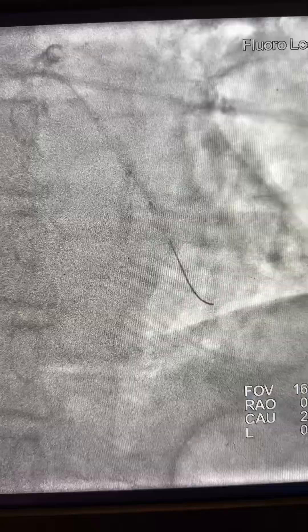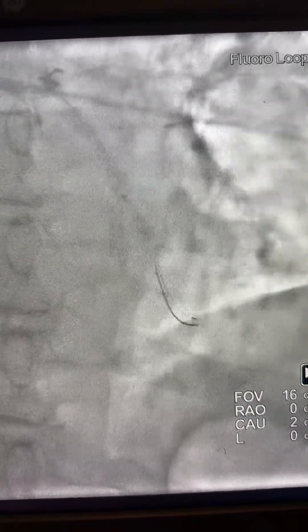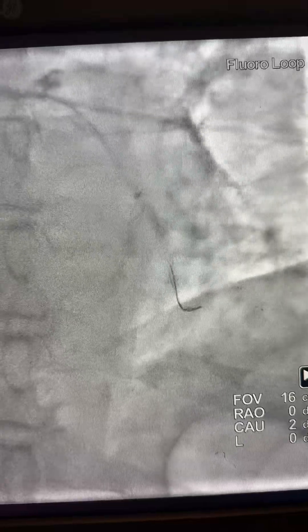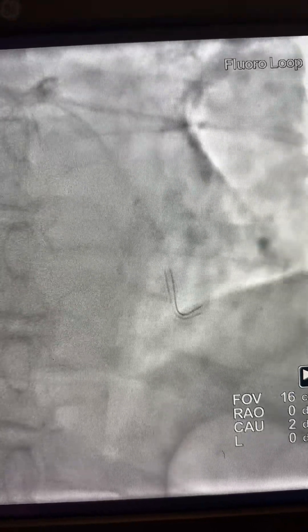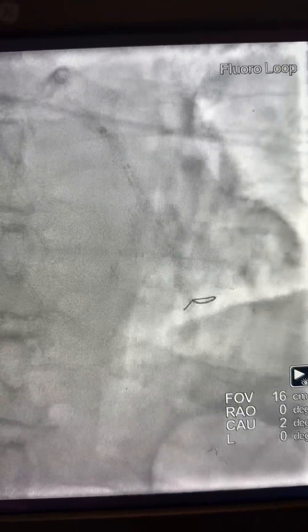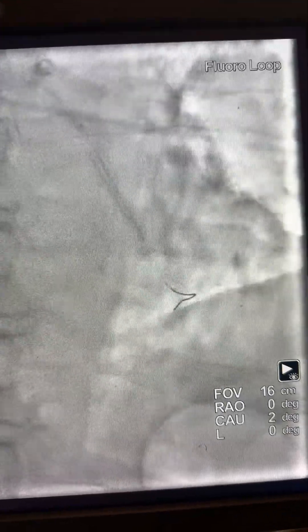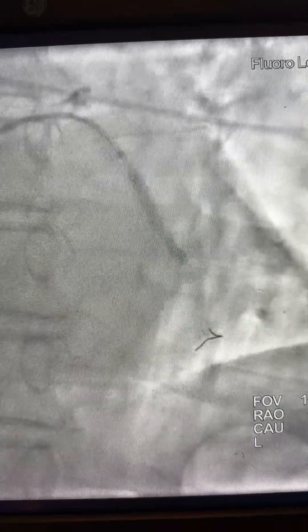Now the balloon went through, so we can dilate. This is a 1.0 or 1.5 balloon — then we upgraded to a 2.0 balloon. Here we're advancing a larger stent, 3.5. We advanced the stent first, then sheathed the stent, pulled the guide liner, and deployed the stent at high pressure.